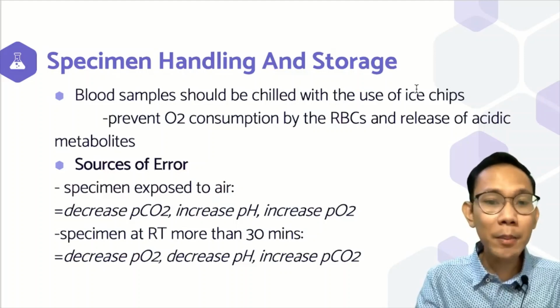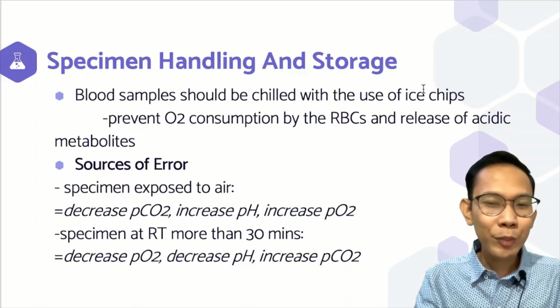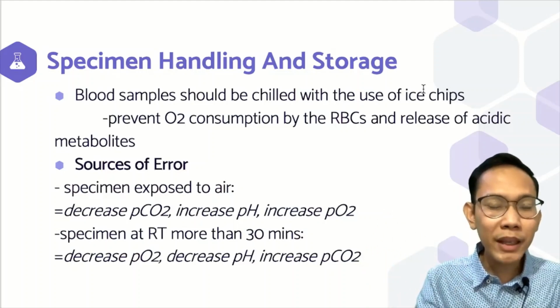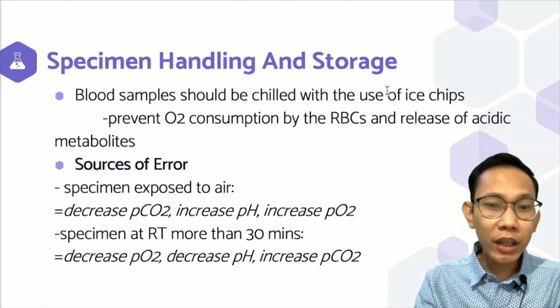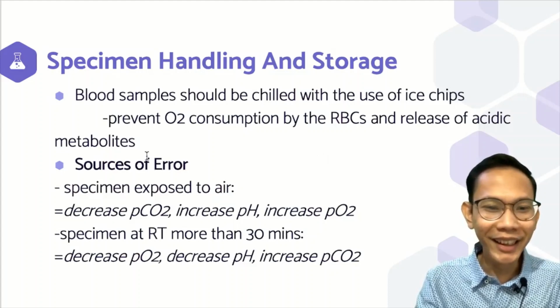As long as masubmit as soon as possible, preferably with use of your ice chip. So, hindi na namin binibigay sa mga watcher kasi most of the time nagugulan sila kung saan nila idadala or what. Or may times na hindi pa nila nabigay doon sa RT. So, therefore, magiging erroneous na yung result. So, kami talaga nagdadala nun eh.